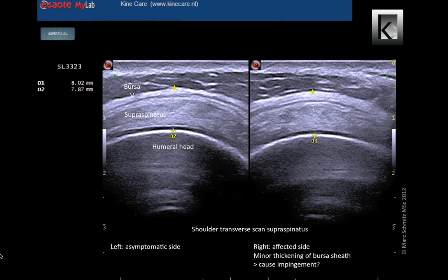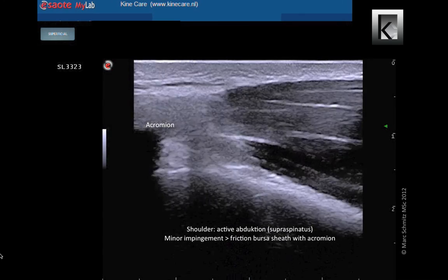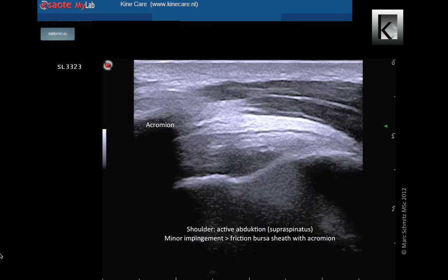Here you can see the shoulder of a professional gymnast. After three months of training, a perfect supraspinatus quality can be seen on both sides. At the right side a minor bursa sheet thickening can be seen. This results in a tiny friction with the acromion with active shoulder abduction. The patient was given advice and some exercises and we stopped treatment. The small friction between bursa sheet and acromion can be seen while the patient makes an abduction movement.